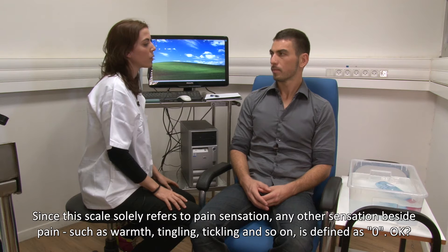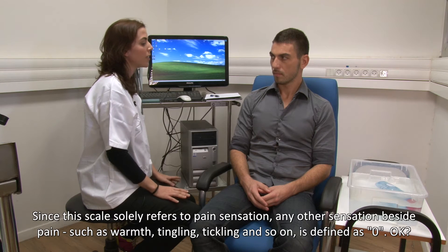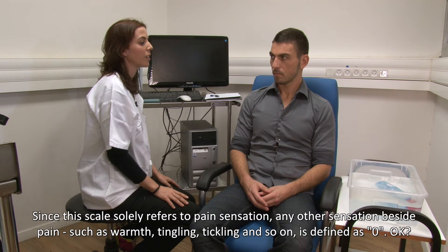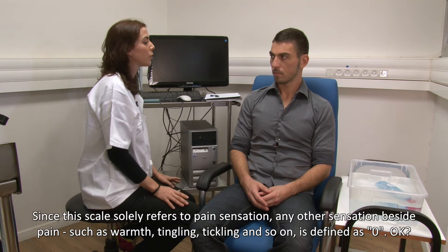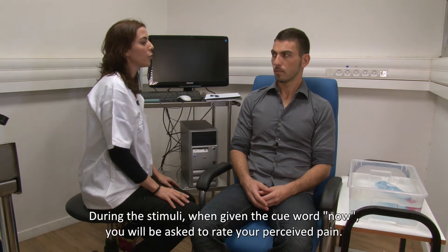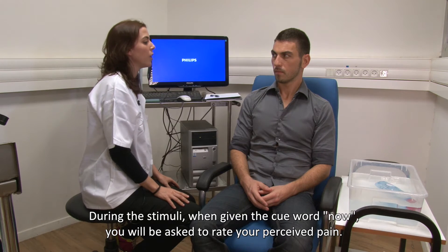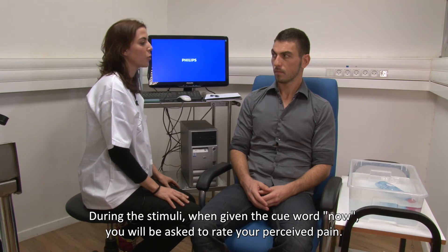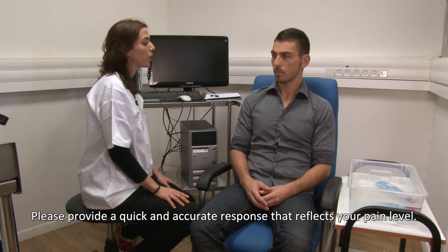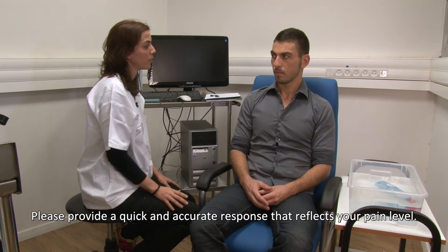Since this scale solely refers to pain sensation, any other sensation besides pain — such as warmth, tingling, tickling, and so on — is defined as 0. During the stimuli, when given the cue word "now," you will be asked to rate your perceived pain. Please provide a quick and accurate response that reflects your pain level.